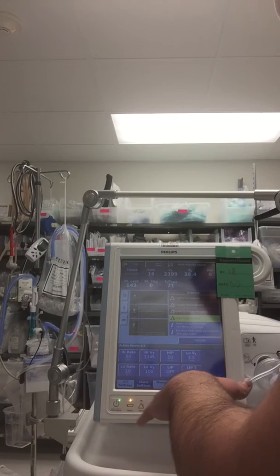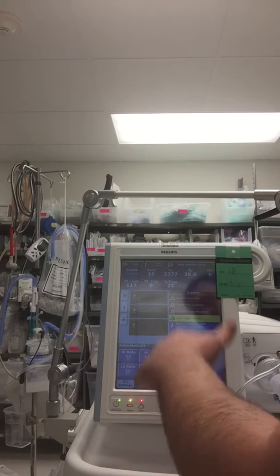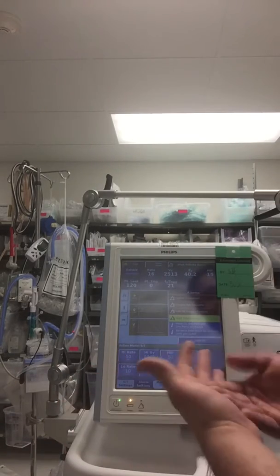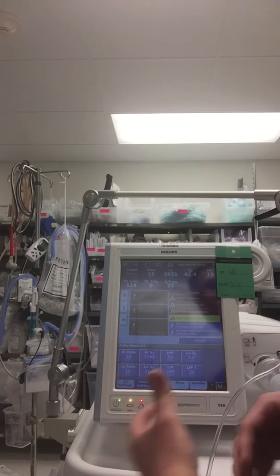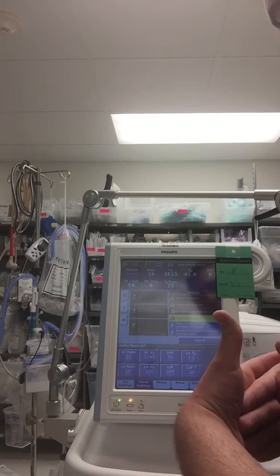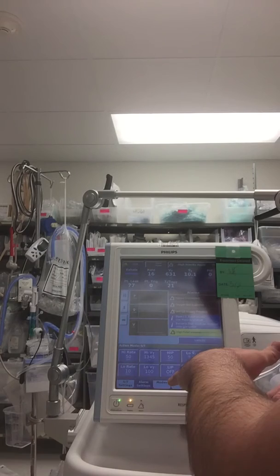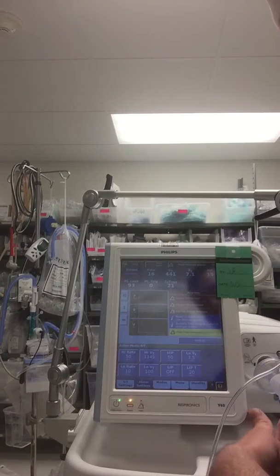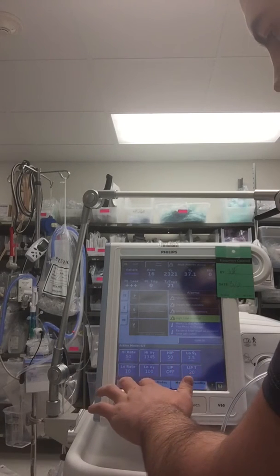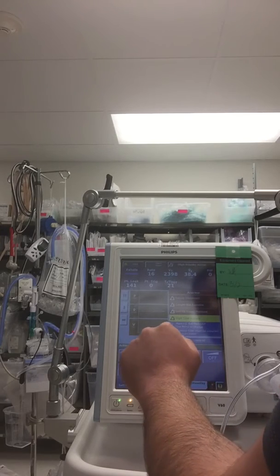We have the low tidal volume set at 100 milliliters. So if they drop below that, or if there's a leak, or if there's something wrong with it, it'll sound. That way we can come get it fixed. The patient is still having a ventilation. Let's see. So we've got minute volume set at 3.5 liters per minute. So leave that. And for the EBG, let me see here.